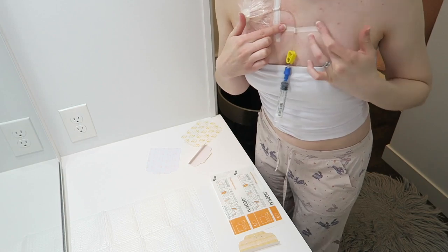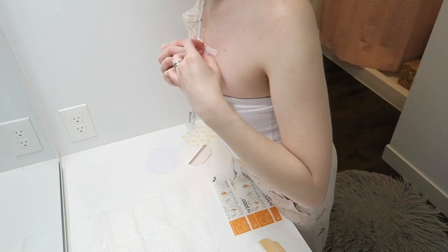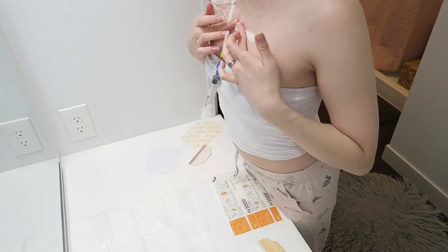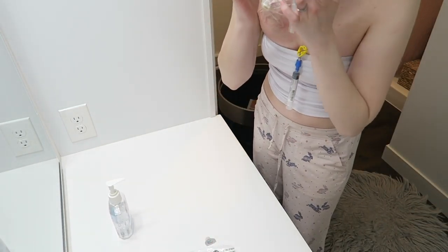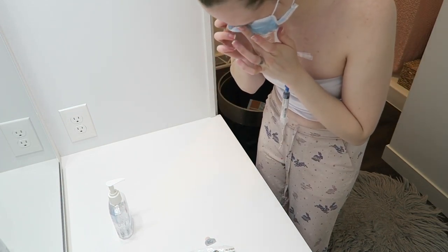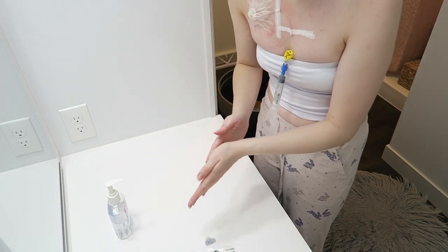This again helps another layer so that it's not being pulled too much. Again, everyone has their own method on what they like to do, so everyone's gonna have a different way. And we are gonna go ahead and flush the line with heparin. This is only needed because I am not going to use my port today. I am not going to do a saline infusion, but I will be doing one tomorrow morning.